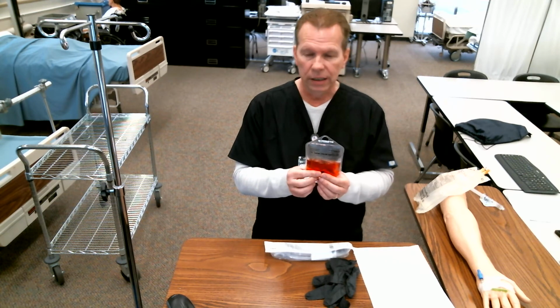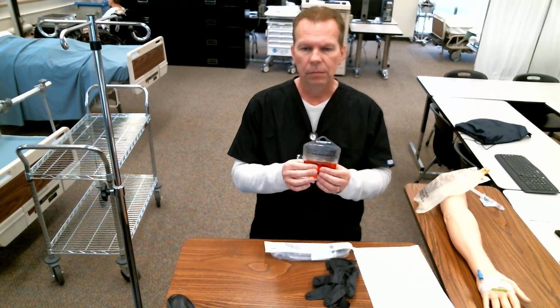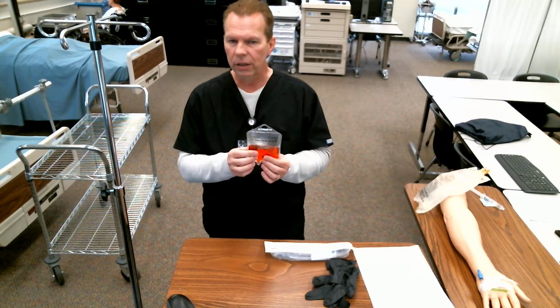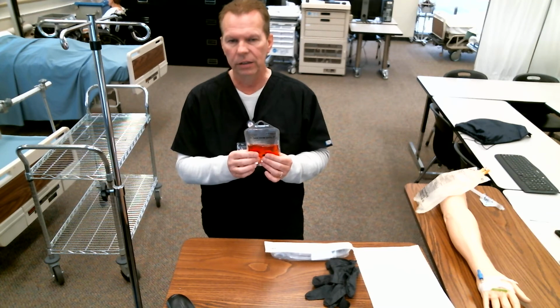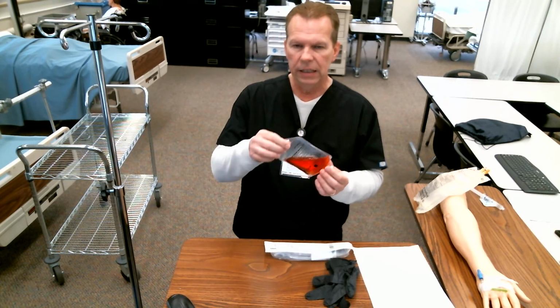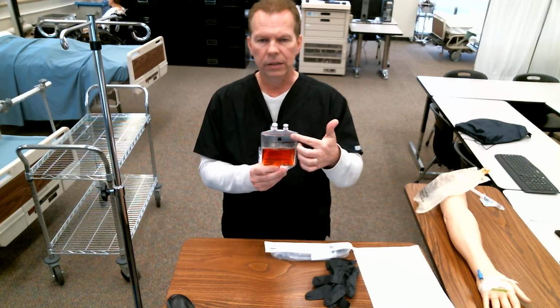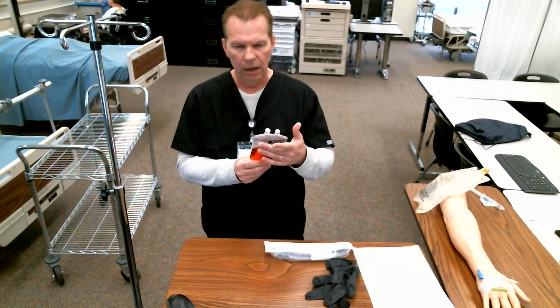You want to gently palpate in here and feel to see if there's any clumps or clots. So if you've got clumps or clots that you think you're feeling in there, the blood is bad. We can't accept that, can't give that to the patient. Also, I like to take it and turn it up and look along there and see if there's any black pepper-like sediment in there.